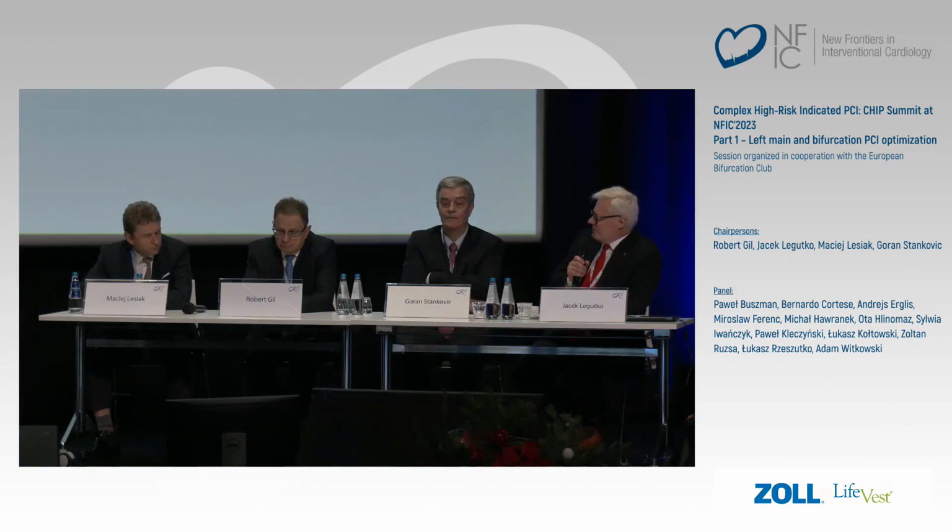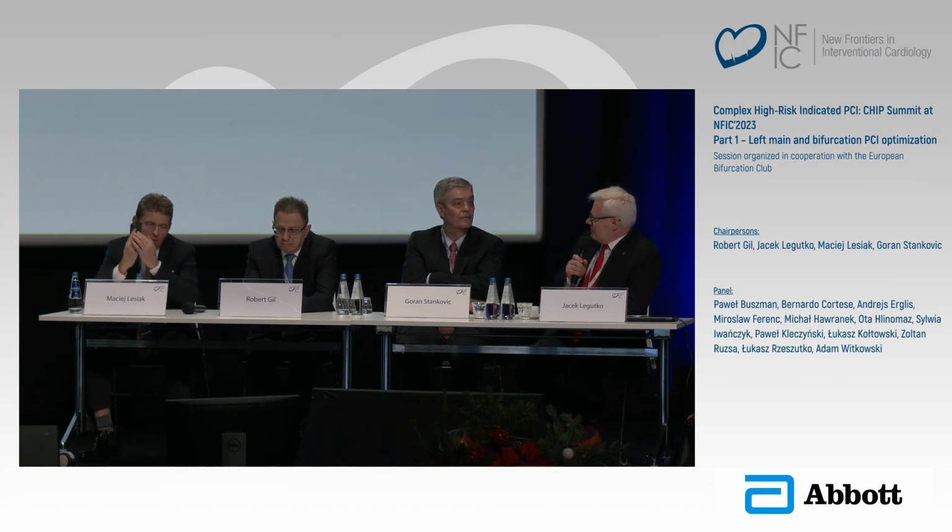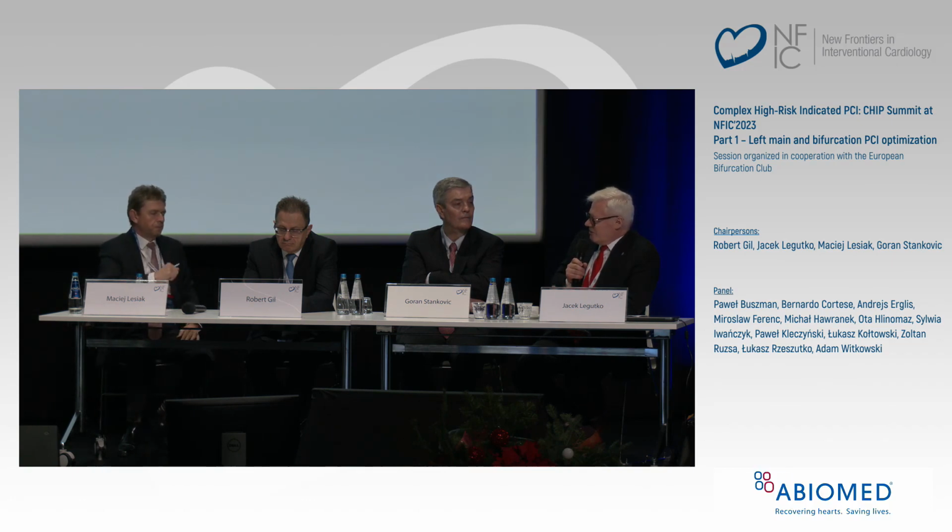So thank you. I believe that there were a lot of concerns about the safety of the use of IVL in left main because we need to do multiple inflations, and of course we need to wait for around 15 seconds to deliver 10 pulses. But usually this is well tolerated by the patients. And if we have hemodynamically compromised patients now with low ejection fraction, we usually use support from left ventricular assist devices, so then we are absolutely safe.